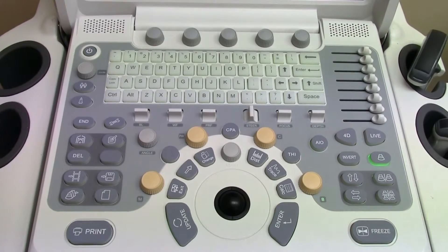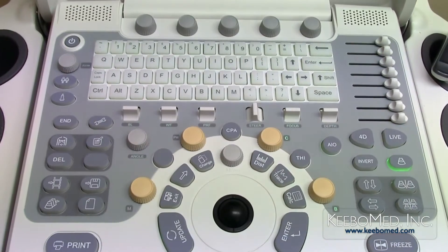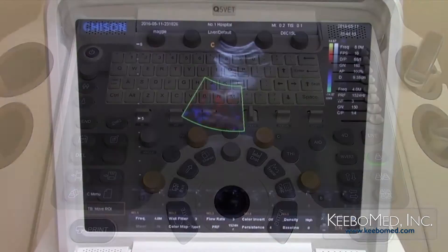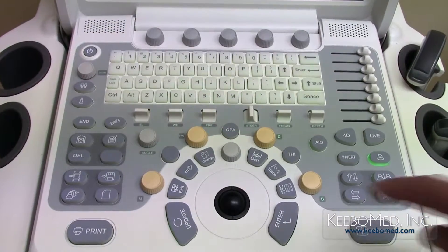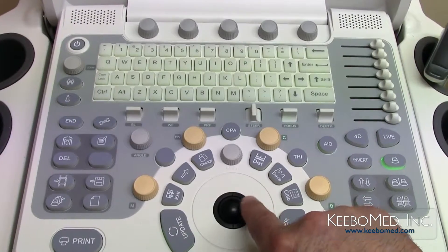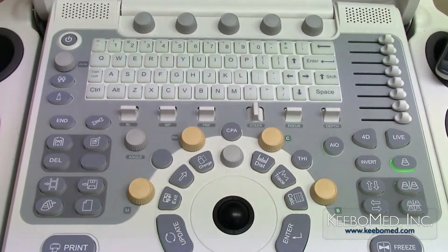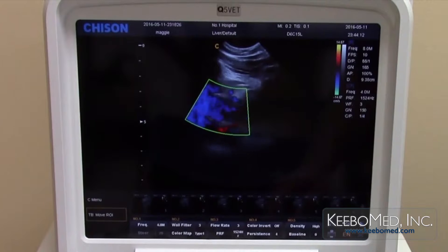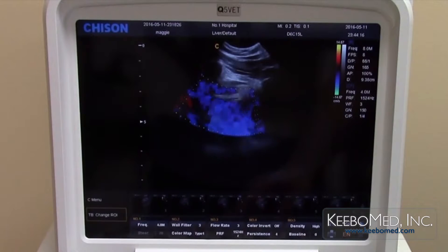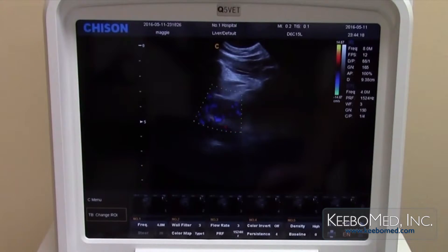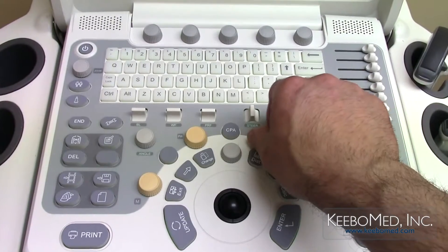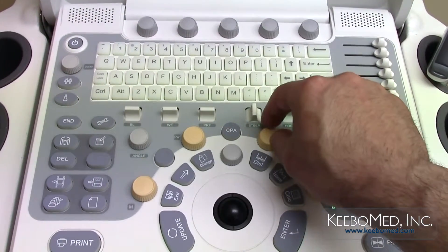To select C mode, press the C mode button and a box will appear on the image. To adjust the size of the box, press the enter key and move the trackball. Note that making the box too big will reduce the frame rate. Rotating the C mode button will adjust the gain of the image.